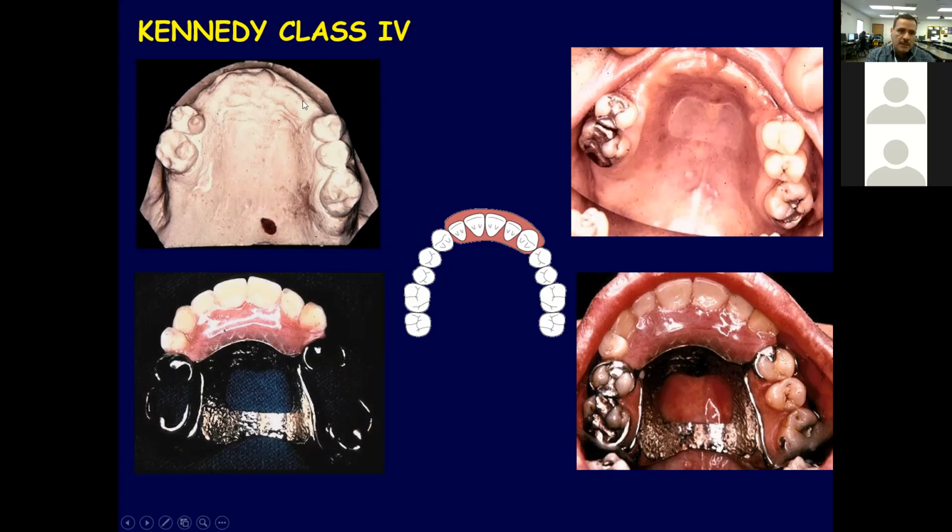And most people lose all these front teeth because of a trauma. They've been hit or something. Sometimes they have gum disease, but usually gum disease will affect the back teeth, molars, and the front teeth. Yeah, so in this case, this patient is missing the front teeth around the midline, replaced by this partial denture.